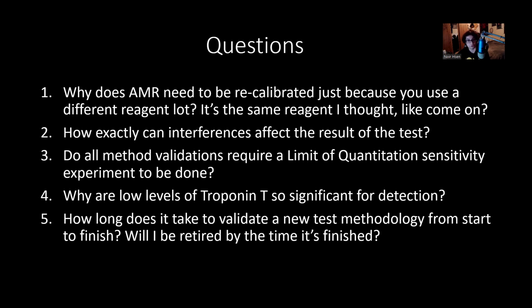They're getting 0.025. You test them again. They get a 0.031. Then the physician's thinking to himself, hey, this person's suffering from myocardial tissue damage. We better start treatment to reverse the troponin T levels, or to reverse any damage that's done, because you don't want the patient to have a heart attack.